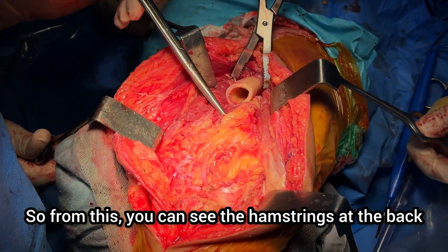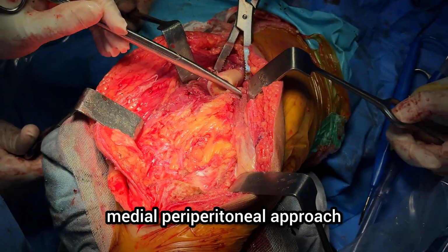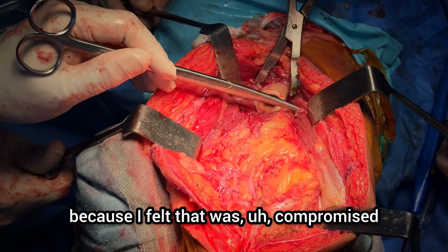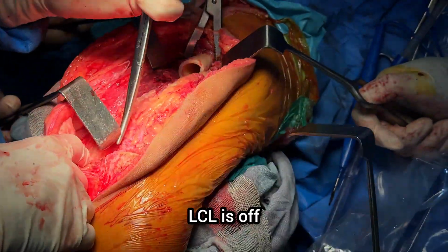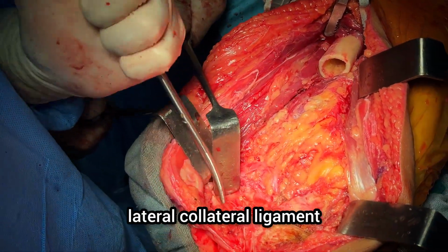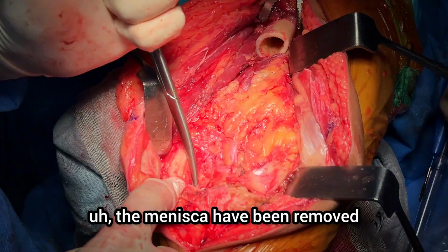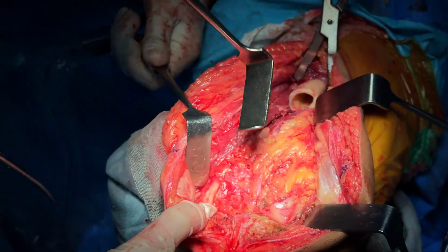So from this you can see the hamstrings at the back. You can see the quads on the side, medial parapatellar approach. We have had to take a bit of the medial aspect of the quad, so part of the VMO region off as well, because I felt that was compromised. MCL is off, LCL is off. Obviously you can see a little bit of the remnant of the lateral collateral ligament. This is the biceps coming in this way here, biceps femoris. And posterior capsule, the menisci have been removed. Behind this are the vessels.